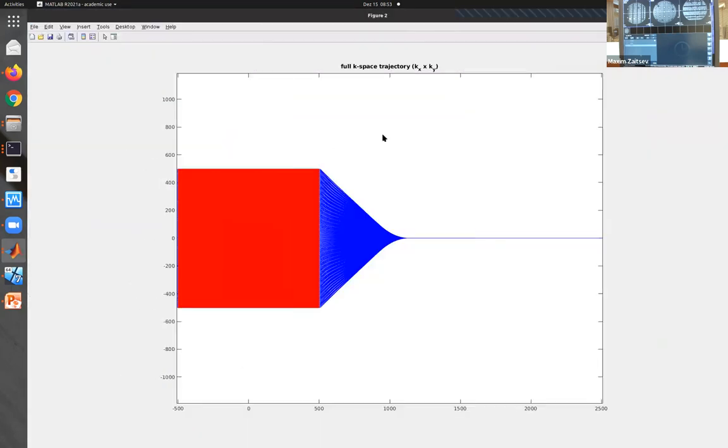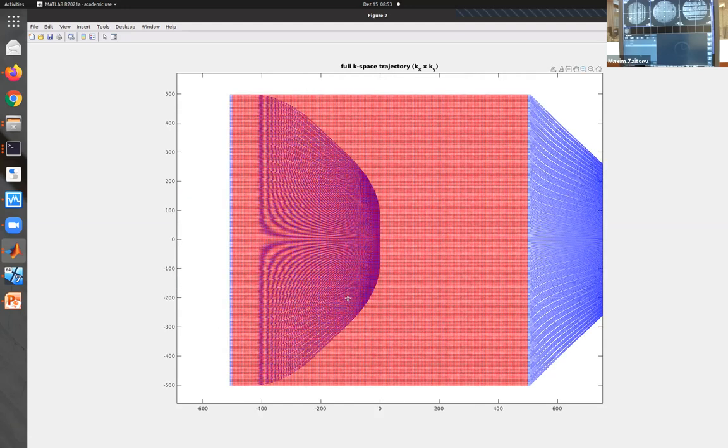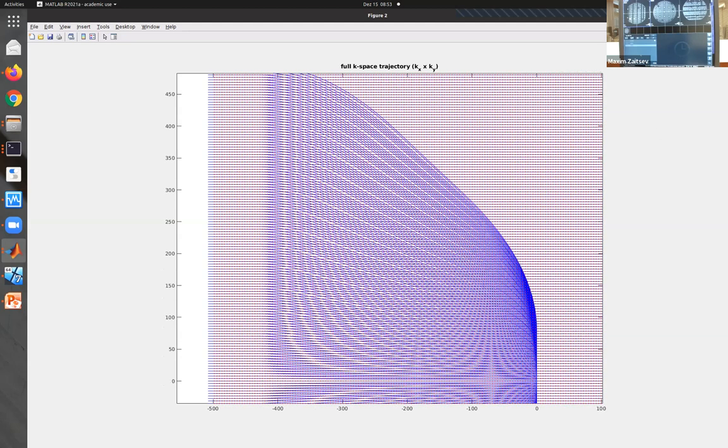And one thing I really like to look at is the k-space. Again, we're looking now at the entire k-space of the sequence, and the red dots visualize the sampled points. You can see the initial prephasers and then the actual readouts. So you can really see in a lot of detail what's going on with every shot.